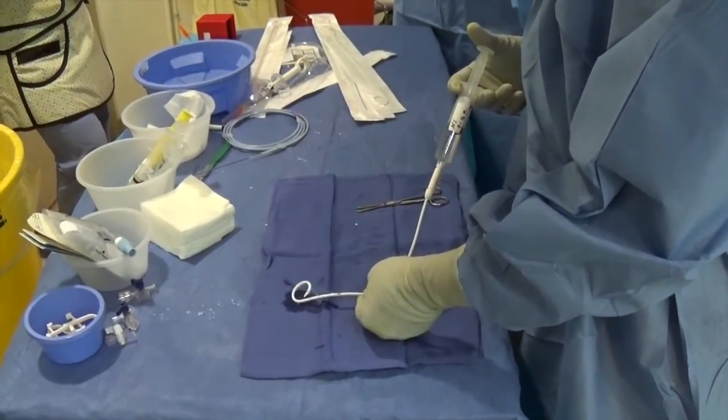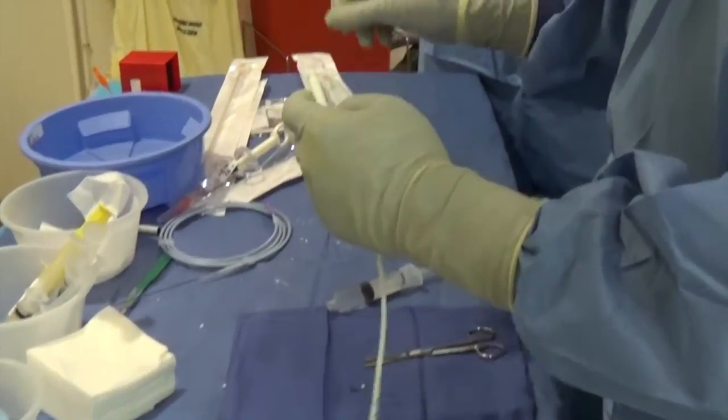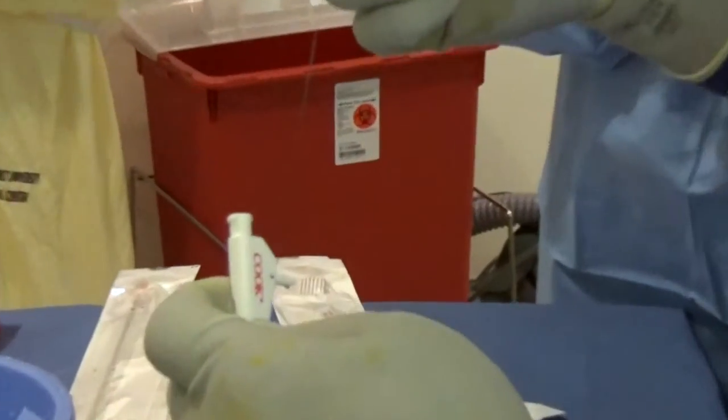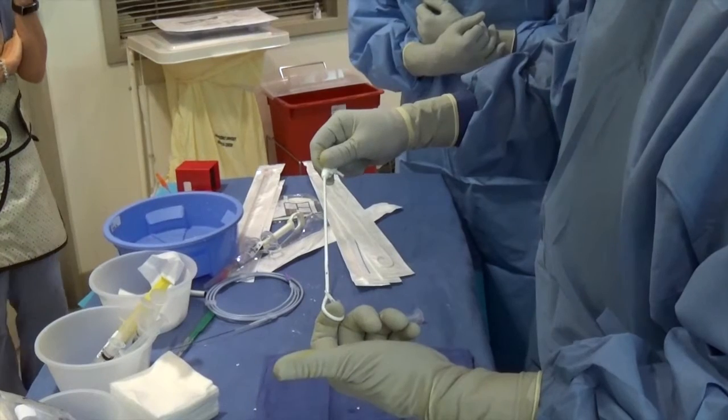And then you just want to flush and make sure that you have it. And then the final thing is you want to make sure you haven't cut your string. Make sure you pull your string tight so that it works.